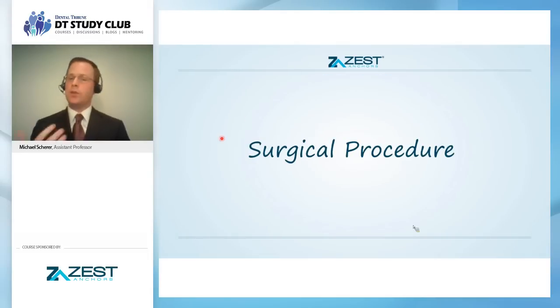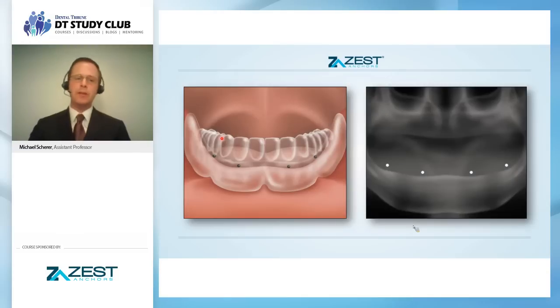So let's go ahead and start with the surgical procedure in regards to the Zest LODI implant. Typically, the traditional methodology we recommend is to duplicate our patient's existing complete denture in clear orthodontic resin.